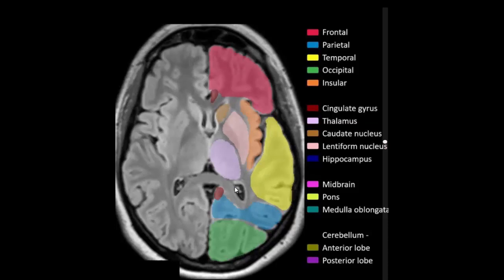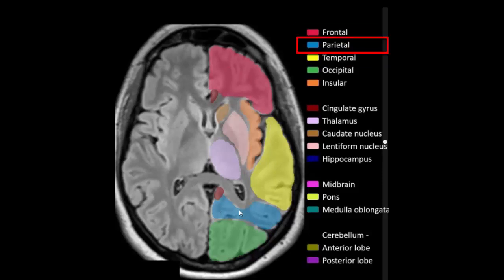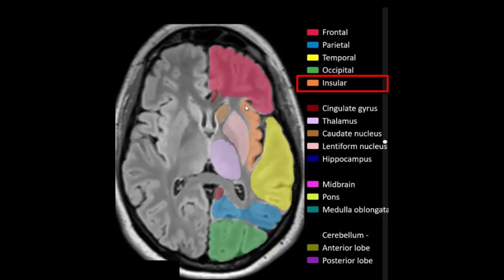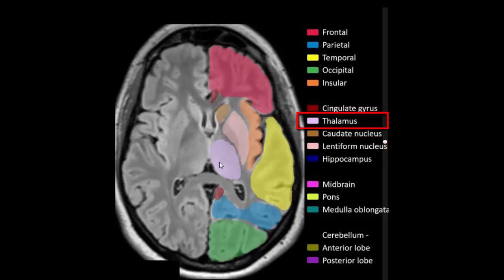Frontal lobe, temporal lobe, parietal lobe, occipital lobe, insular cortex, lentiform nucleus, thalamus, head of caudate nucleus. Right and left anterior horn of lateral ventricle, cingulate gyrus.